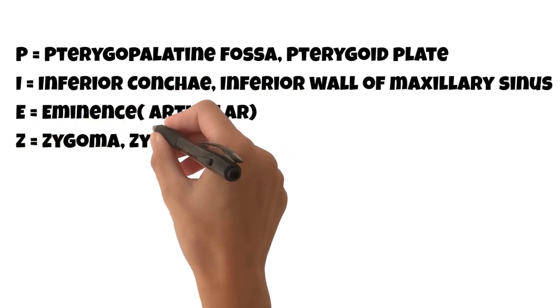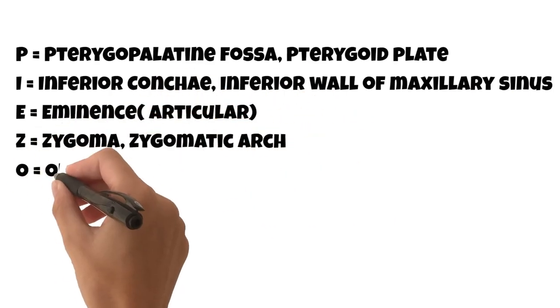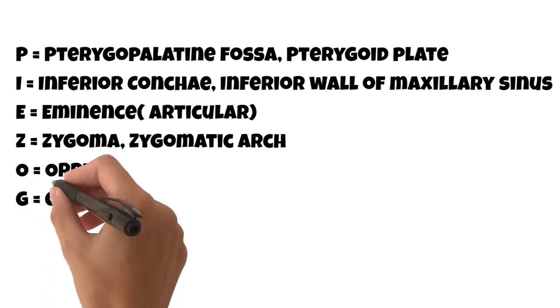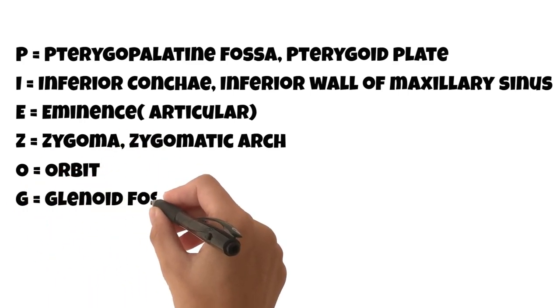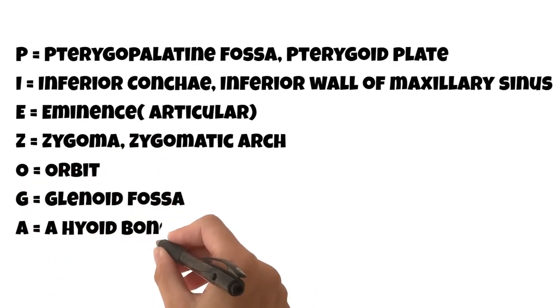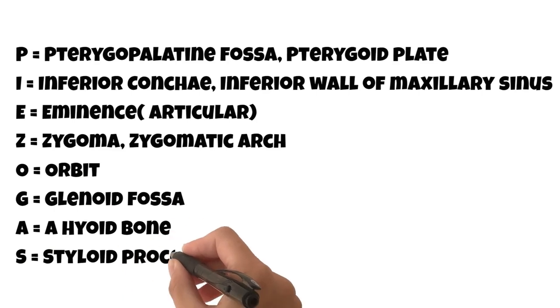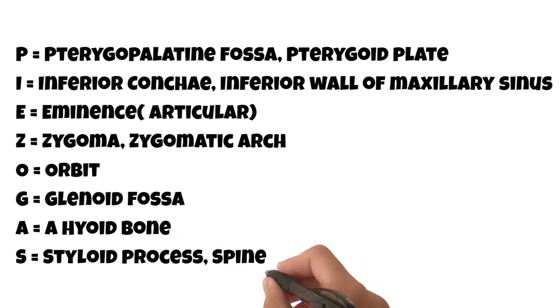Z equals zygoma and zygomatic arch, O equals orbit, G equals glenoid fossa, S equals styloid process, and S equals the cervical spine.